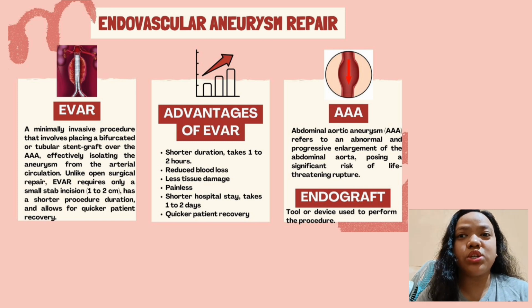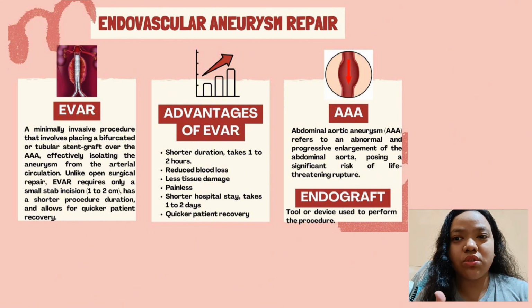It has a shorter duration because it only takes 1 to 2 hours, while sa open surgery, nagtatagal lang 3 to 6 hours. So, imagine yung time na na-lessen. Second one is quicker patient recovery. Yun nga, dahil maliit lang yung incision. And then, marireduce din yung blood loss, malilessen yung tissue damage, and less pain. Hospital stay naman, yung EVAR is mas shorter because 1 to 2 days lang sila doon, while sa open surgery, 4 to 7 days naman.